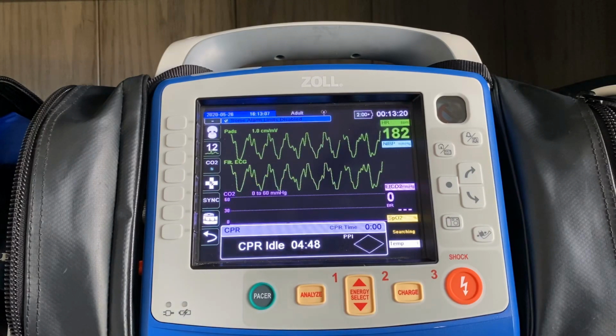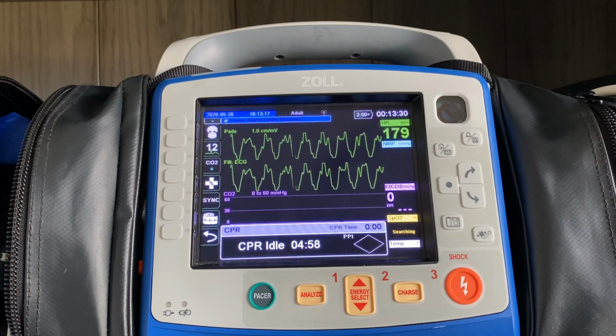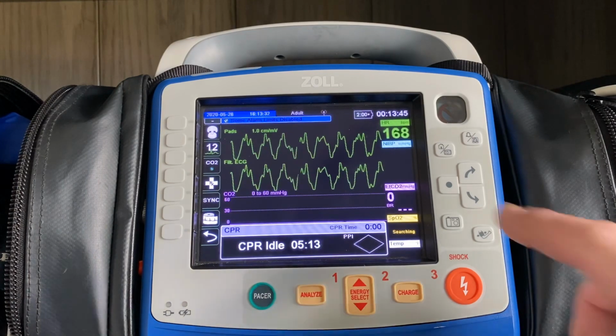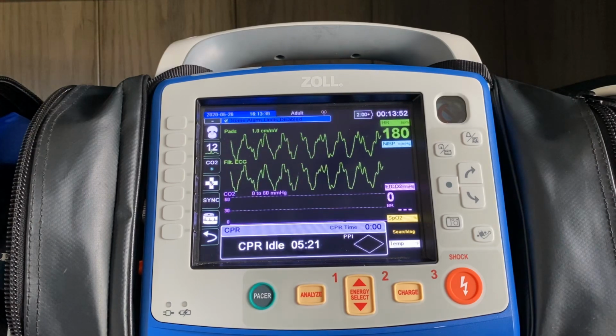The other values that present themselves are on the right-hand side here. That's going to be your millimeters of mercury level, which is measuring the pressure of the CO2 leaving the chest cavity. And also it's going to be your respiratory rate right underneath there. So if you think about a dead patient, a cardiac arrest patient, there is no cellular metabolism. So what would normally be an exchange of oxygen going in, carbon dioxide leaving the body, that doesn't exist. So that number right there where it says zero is going to be really low. And typically that number is going to be determined by how long the patient's been down and the quality of your CPR compressions.